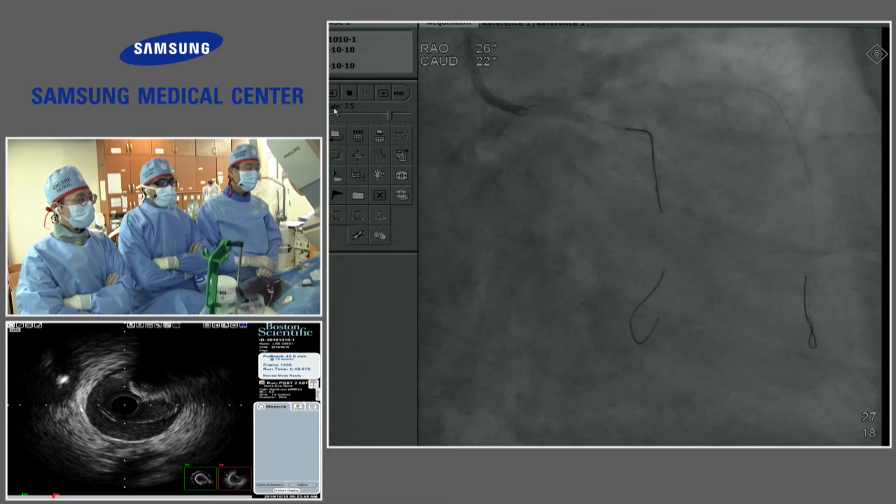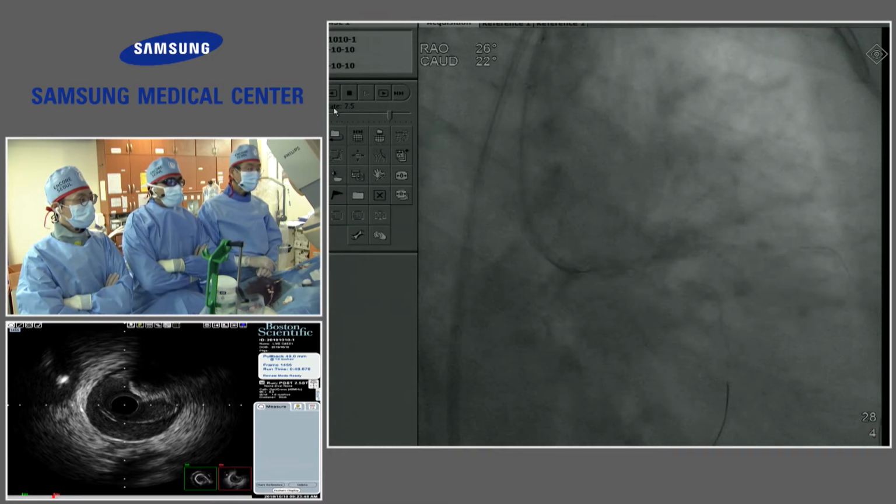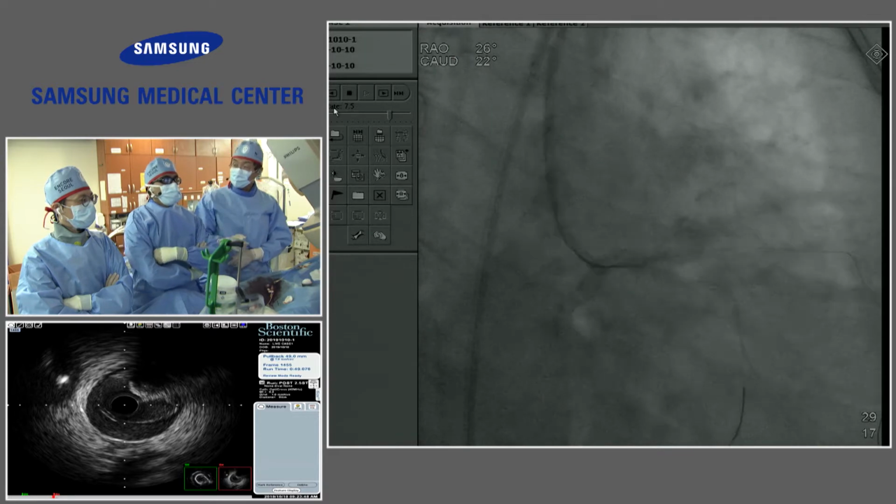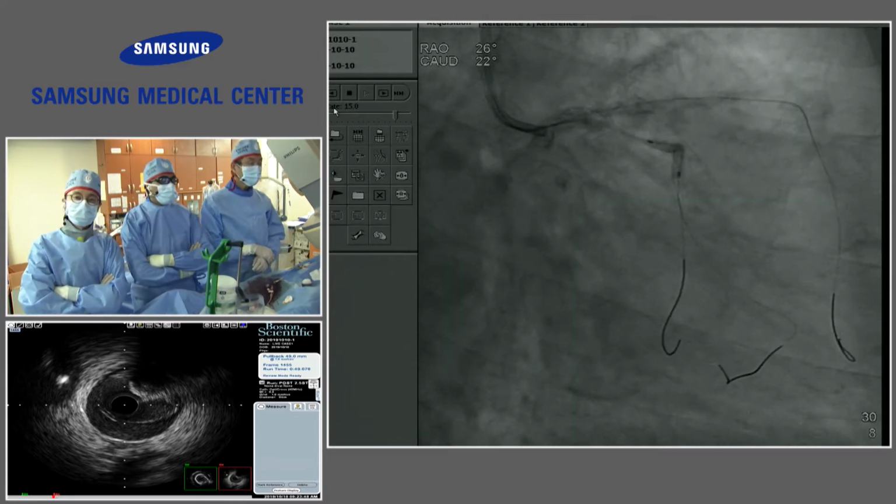Next. Next. So at the time we performed the IVUS, and you showed that, right? Next. I don't think we got that one.